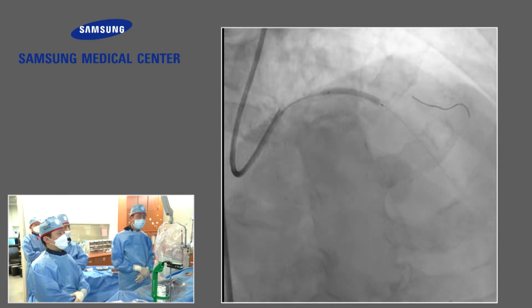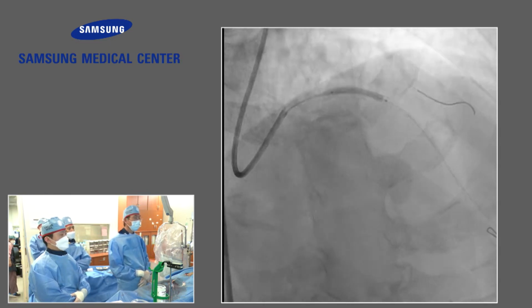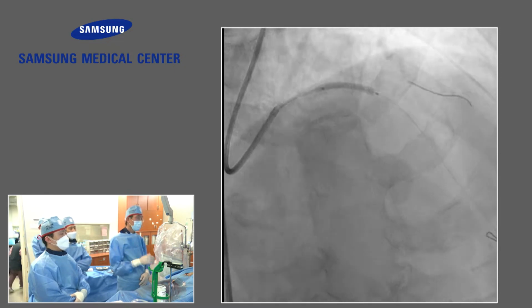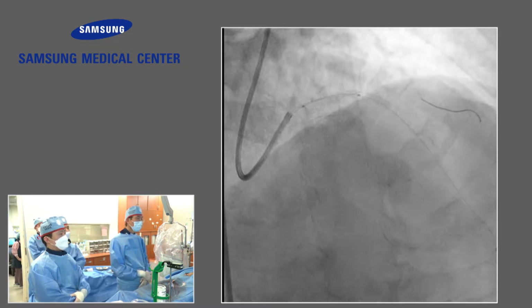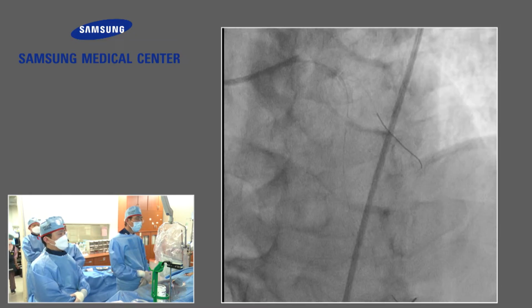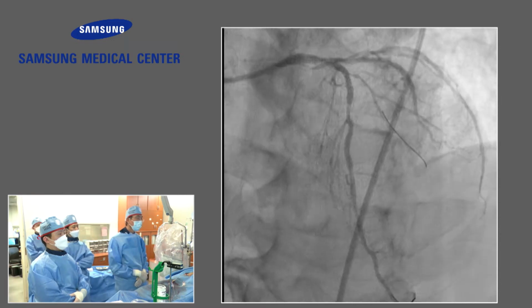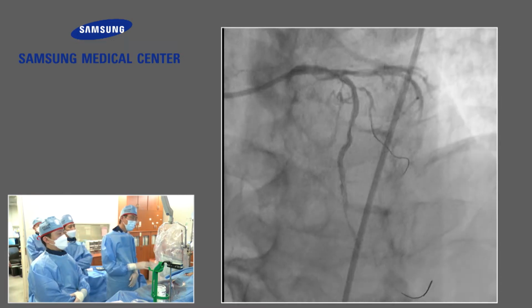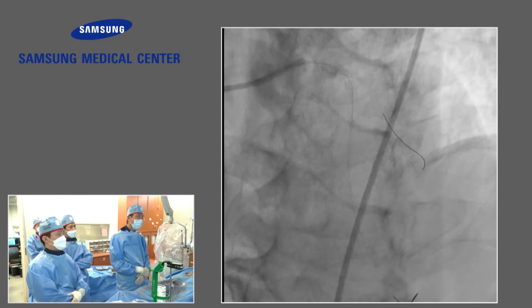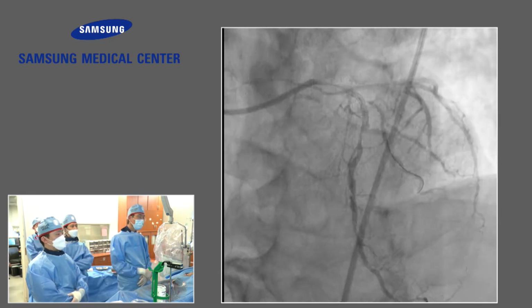Next, 2.0. Then stent, Xience Skypoint 2.75, 23 millimeter, 12 atmospheres. Next. Then flow was actually decreased in the diagonal. Next. So I rewired it. We checked the diagonal. The flow is marginal. So now we can post-dilate the proximal part, then side wiring is possible.